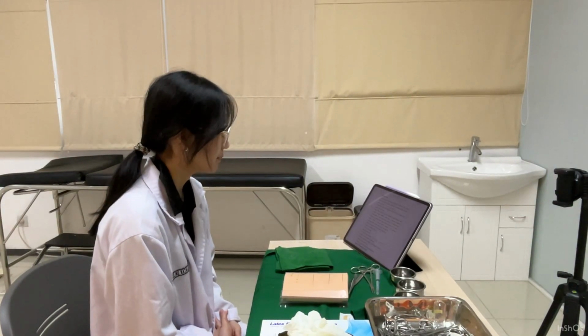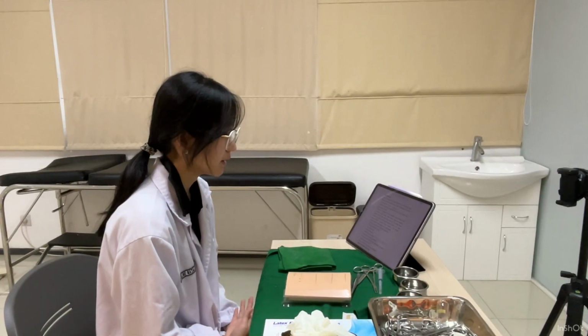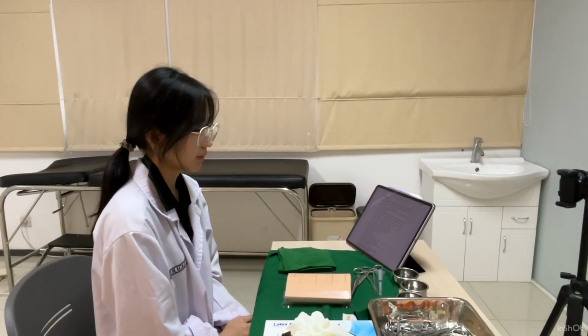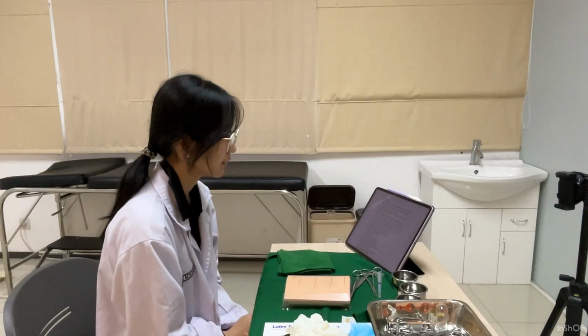Next, I will explain the purpose of today's procedure is to close your wound. So I will apply basic surgical skills, which is suturing, to close your torn skin. And in this procedure, I will inject you with anesthesia and I will suture you. Are you okay with that?